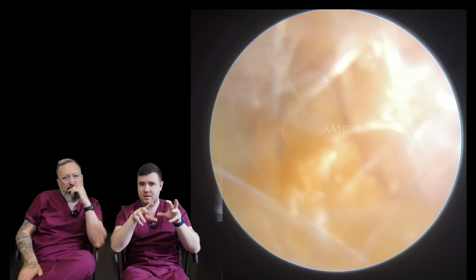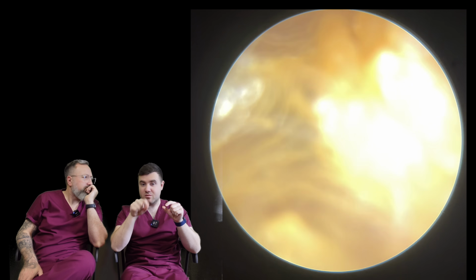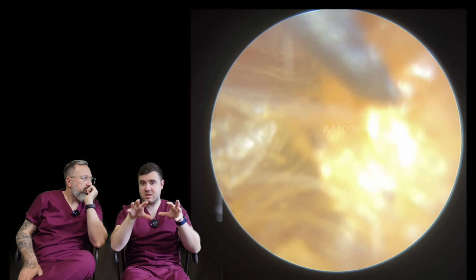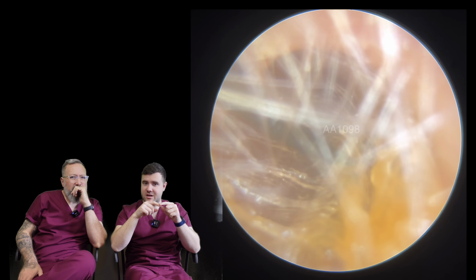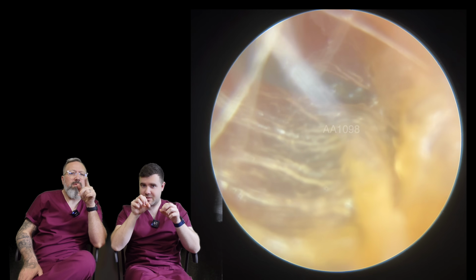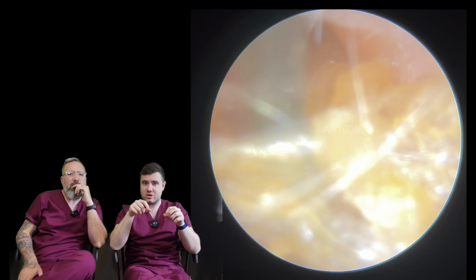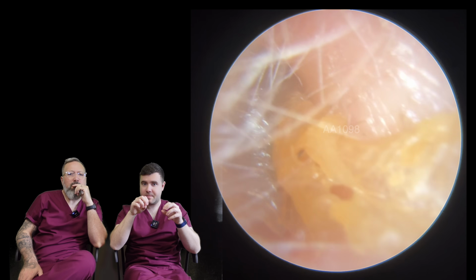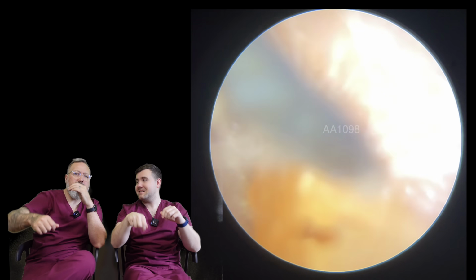What I found quite helpful in some of these cases, if you can get the Rosen inserter or a St. Bart's hook to wrap a little bit of that skin around it, I've twirled the tool once or twice just to gently give that a little bit of a pull. But you can see the Rosen inserter now is actually starting to peel this away, almost like candy floss, wrapping it around the tool. That's it. Yeah, you got it.